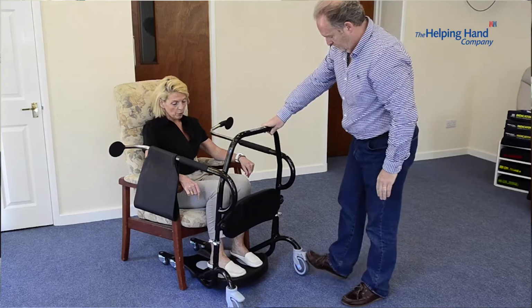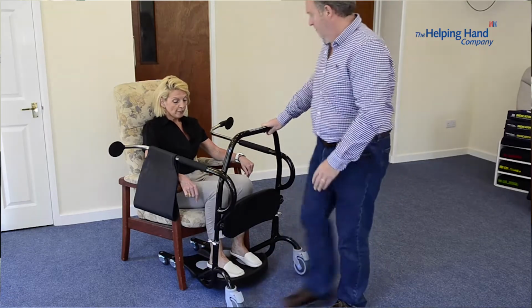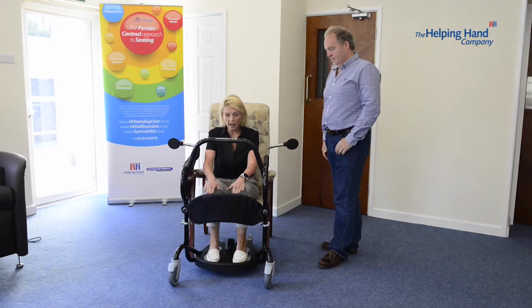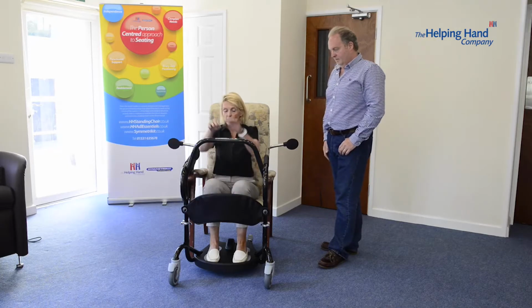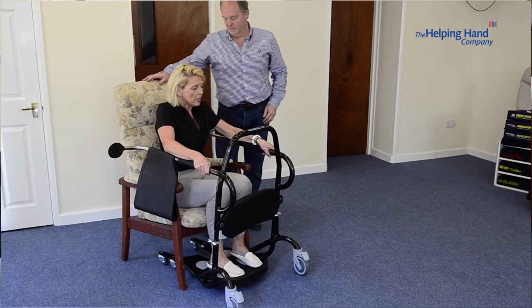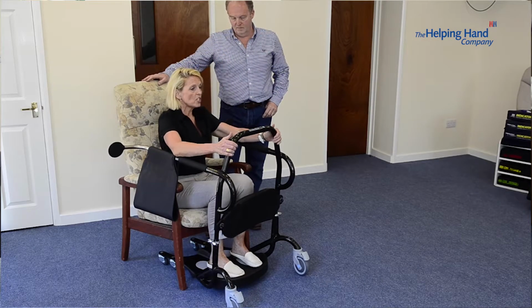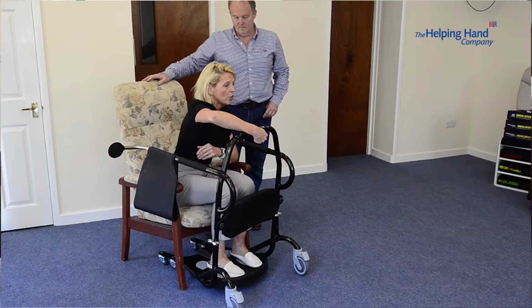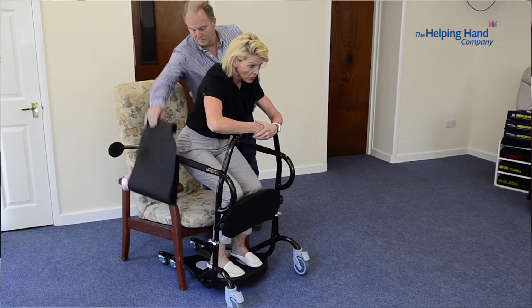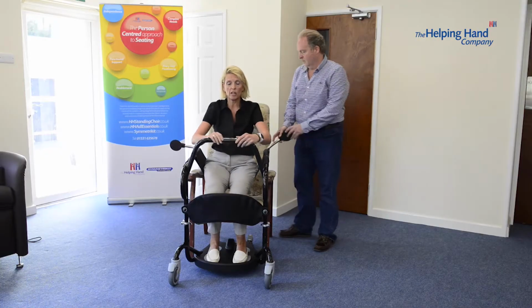Always making sure that we put the brakes on before we start anything. I'm 5'6", so this is on the bottom setting, so you can see my knees are just about parallel to the knee pad. From this position I could be pushing up, depending on what your client's used to doing, or they might be pulling up, or it might be that I'm restricted and can only use one side, so I can be hooking my arm and pulling around, but I don't need to achieve a full stand. Just this half stand. Richard then puts the seat underneath and I sit straight back down.